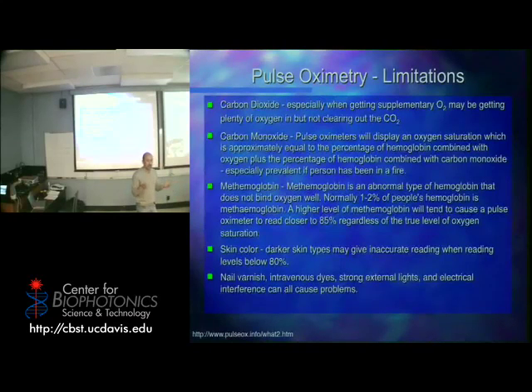Okay. Now, are you measuring oxygen, or are you measuring some other property with the device that you've seen, the pulse oximeter? Are you measuring oxygen? You're measuring bound oxygen to hemoglobin. There could be other oxygen in your blood. I could have a little thing on the side that's pumping oxygen into your blood. It would probably interact with the hemoglobin because the hemoglobin likes the oxygen. But if it didn't, I can't measure that.